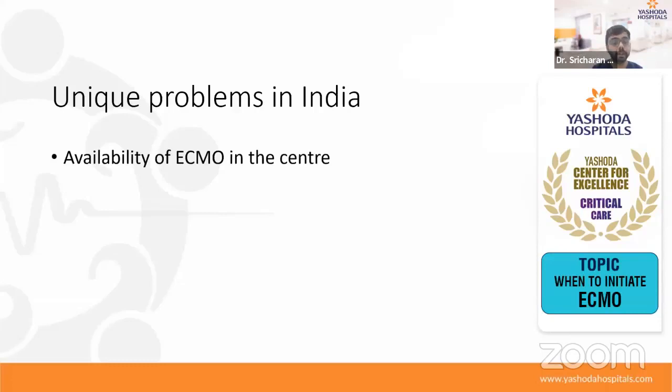These include the availability of ECMO in the center. If ECMO is not available in the center, even if we are ventilating the patient with relatively high power, it is redundant to consider ECMO in these patients unless we are contemplating a transfer to an ECMO center. So the feasibility of transfer to an ECMO center should also be considered in patients who are on stiff ventilation with ARDS.